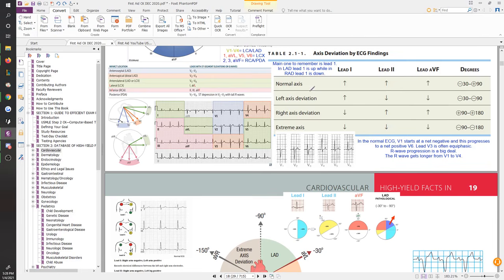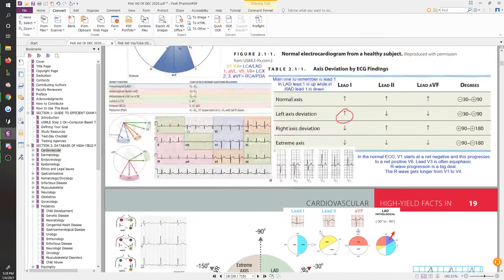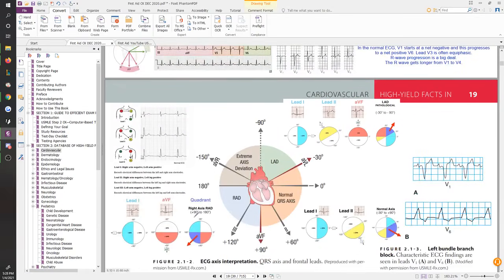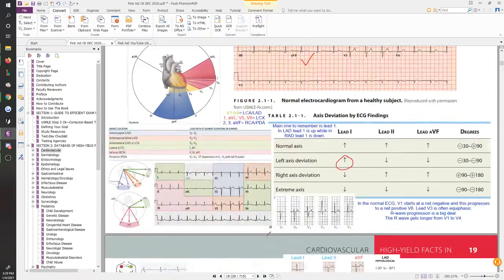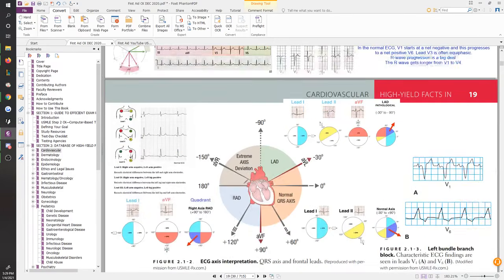If you have a patient with left axis deviation and you look at leads 1, 2, and AVF, lead 1 will be the only one pointing up. Okay, lead 2 and lead AVF are going to be pointing down. That's somebody with a left axis deviation. So if you have this image memorized, which generally speaking isn't so bad because this is actually the same image as what you see here. It's the same stuff. This image is basically the axis circle being put onto the heart, right? So that's exactly what you're seeing right here.